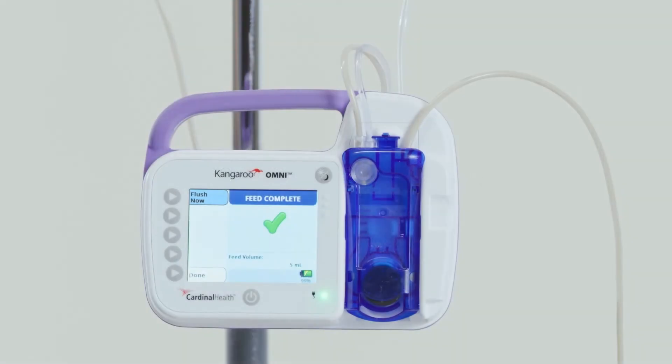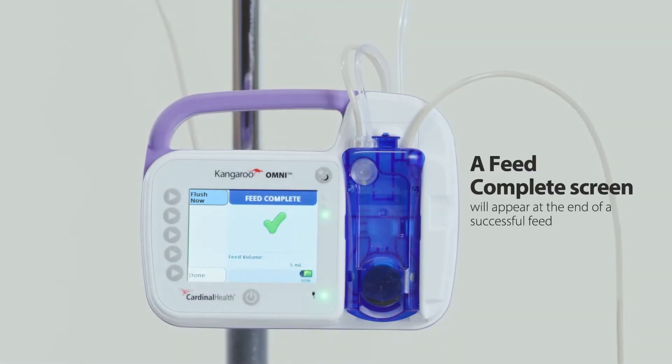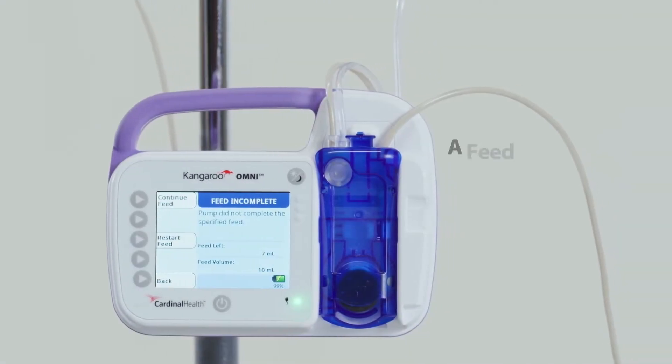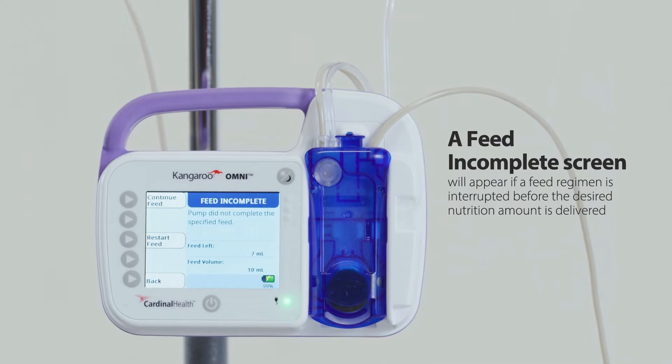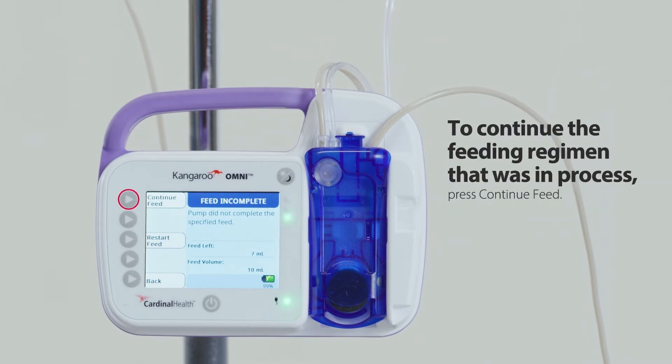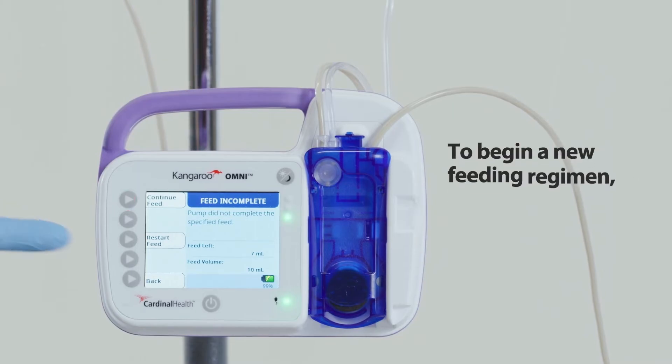Feed complete notification: a feed complete screen appears at the end of a successful single feed or multiple feed regimen. Press done to clear the notification. Feed incomplete notification: a feed incomplete screen appears if a single feed or multiple feed regimen is interrupted before the desired nutrition amount is delivered. To continue the feeding regimen that was in process, press continue feed. To begin a new feeding regimen, press restart feed.